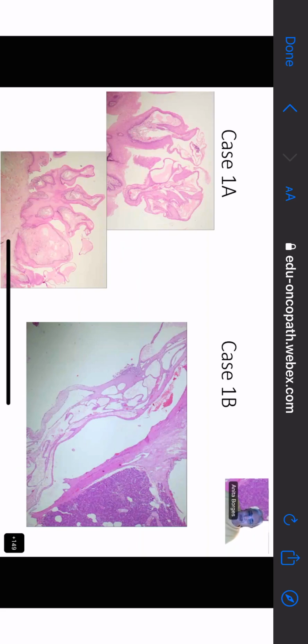When we make an observation, here we have this squamous epithelium growing in an exophytic way, and there are cystically dilated spaces that are filling that stroma, and you put two and two together, and your interpretation is that this is not a papilla. Do you get me, Dia? Does it make sense to all four of you? Yes, ma'am.